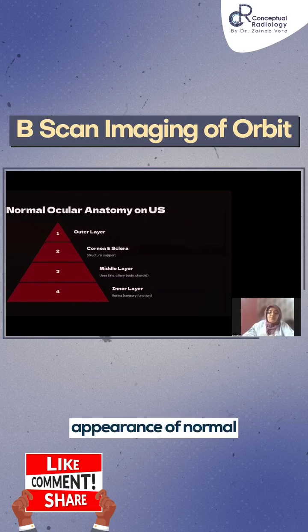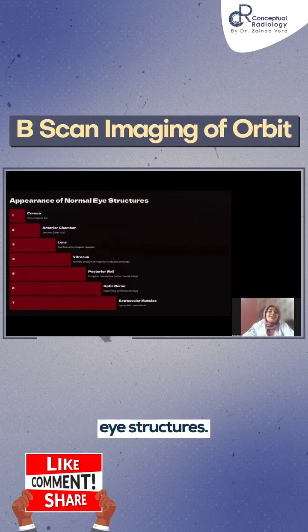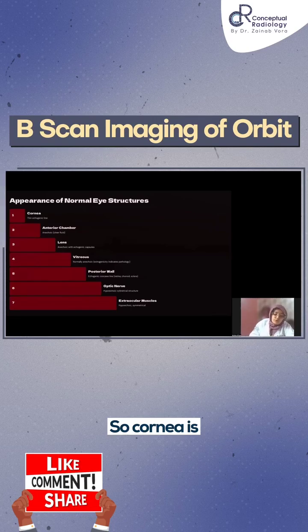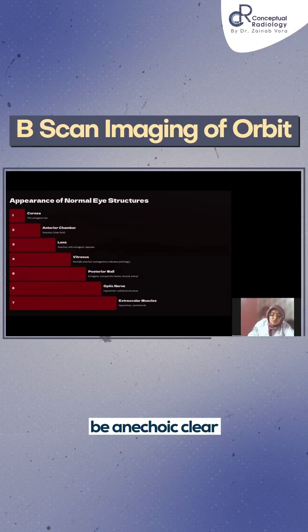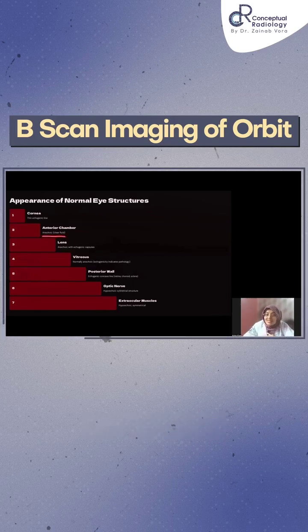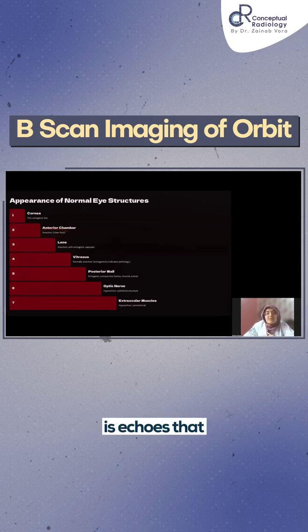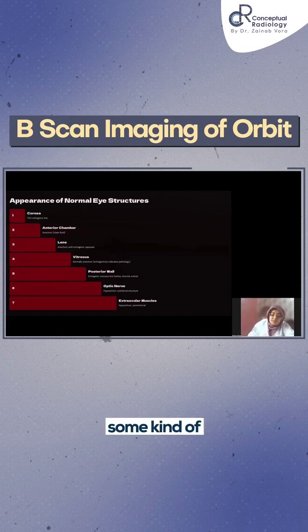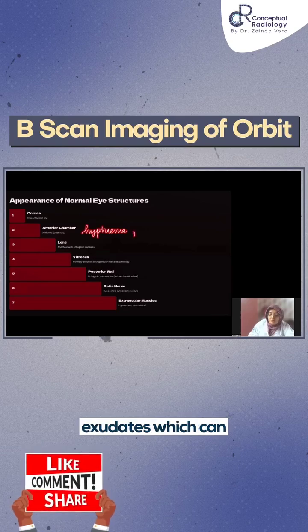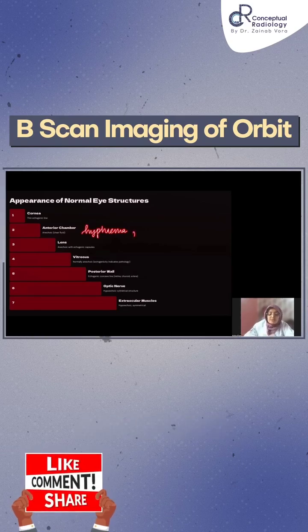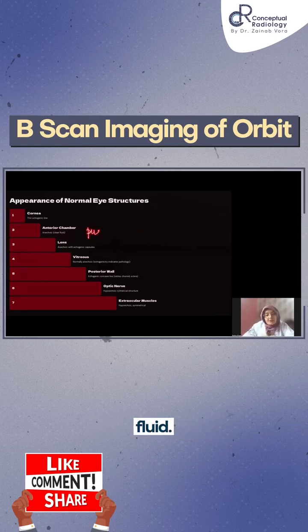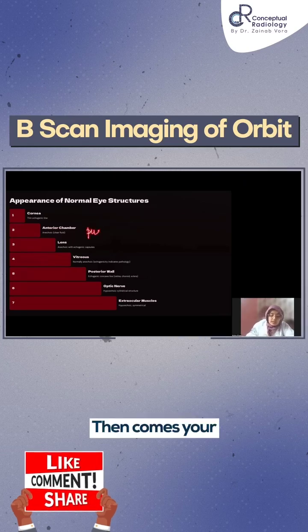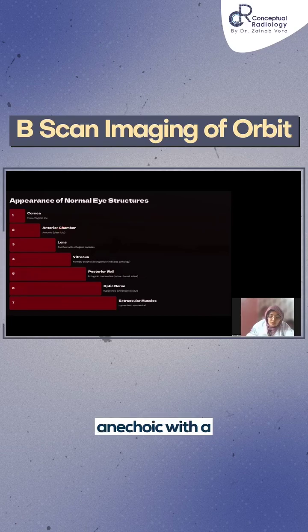Next is the appearance of normal eye structures on imaging. The cornea appears as a thin echogenic line. The anterior chamber should be anechoic — clear fluid. If there is turbidity or echoes, that indicates either hyphema, meaning blood, or exudates such as pus. So the anterior chamber should ideally contain clear fluid.